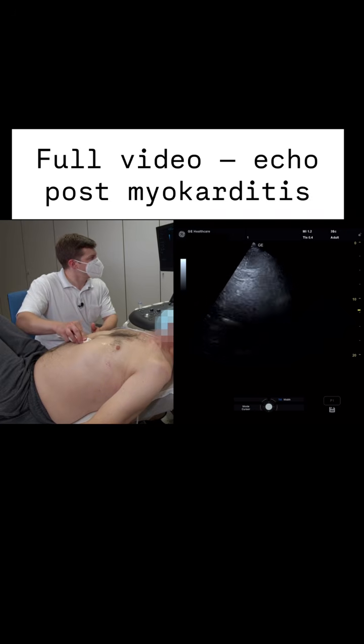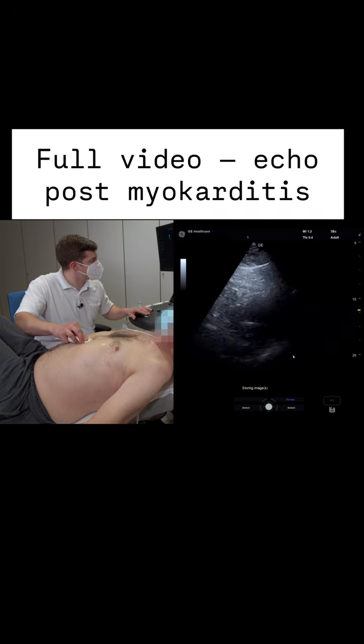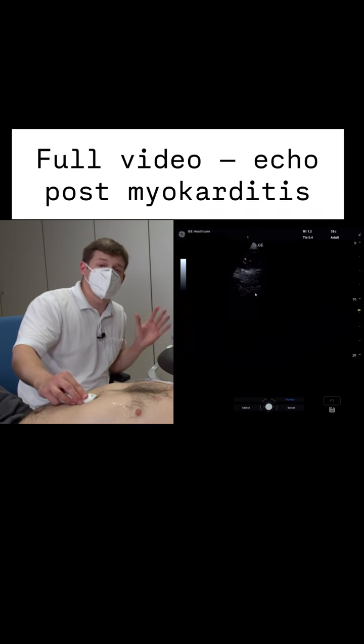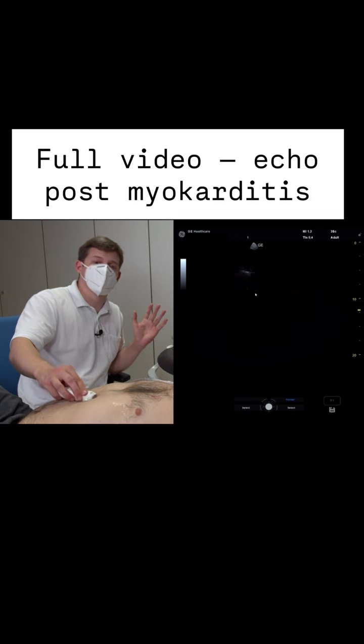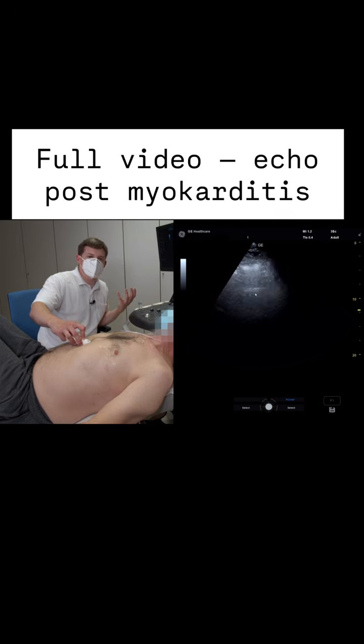When the patient inhales and we apply enough pressure, we see that there are no signs of pericardial effusion. Sometimes if it's hard for patients to inhale, it can be even tricky to get an optimal view from the subcostal approach. But in this patient, we didn't see a sign of pericardial effusion.